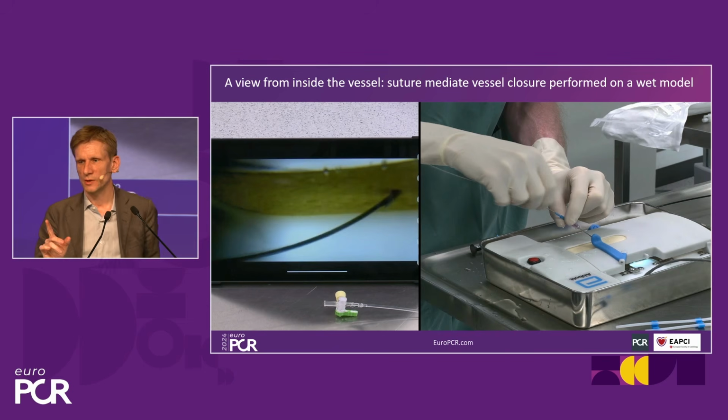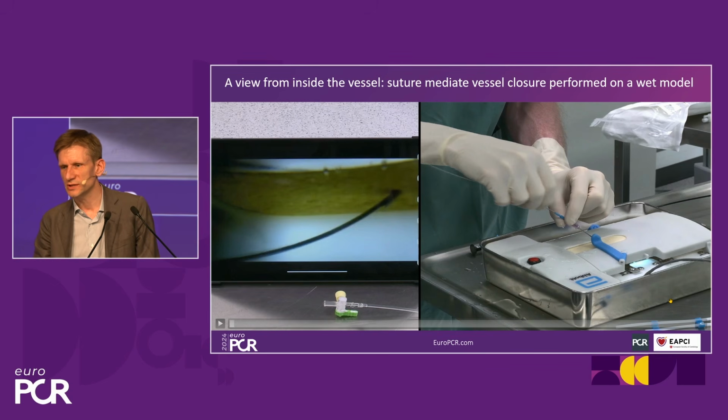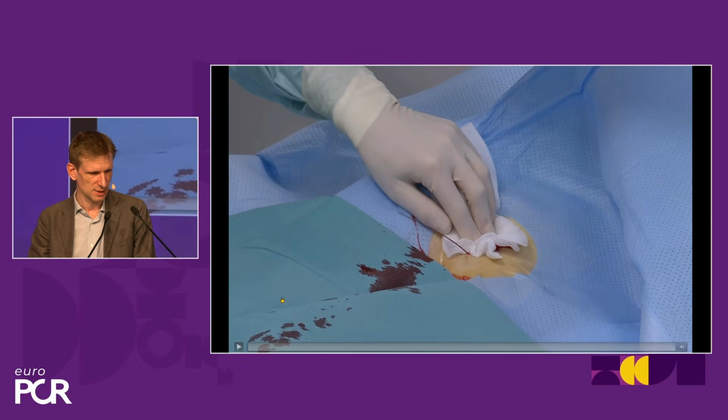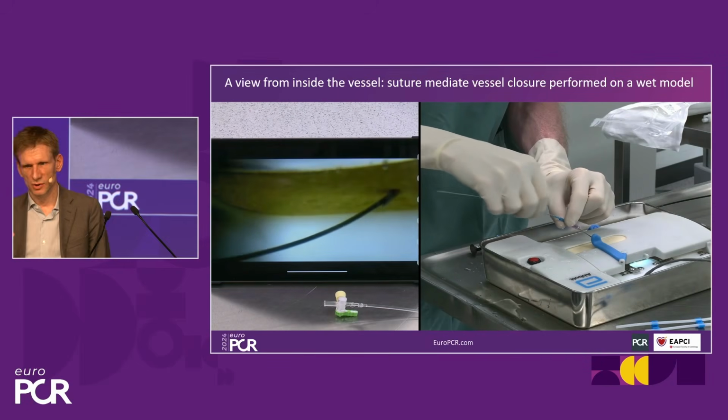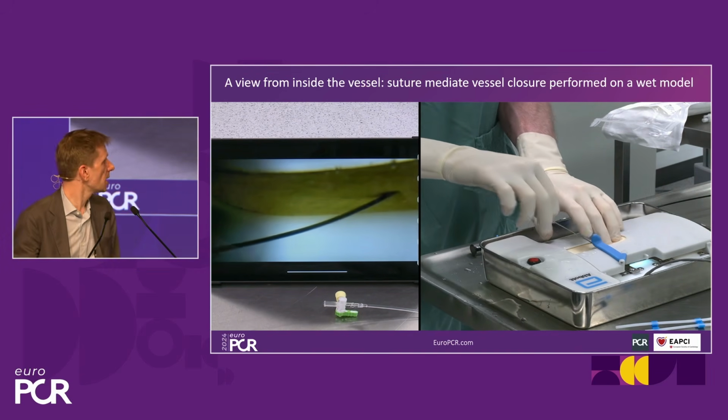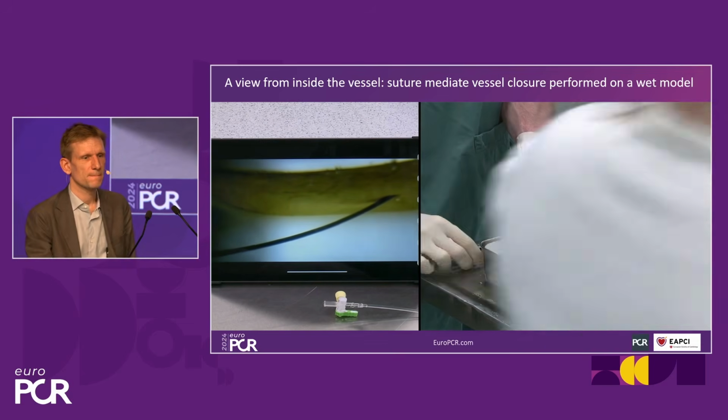So this is a wet model, just out of the patient. This is a video from a camera sitting under here, so that it shows you what's happening intravascularly, and you see what I'm doing with my hands and how we deploy the Pro-style. Yeah, the wet model. Okay, let it play. So, okay, this is puncture, wire goes in. I hope you can see the videos, we're not in the way.